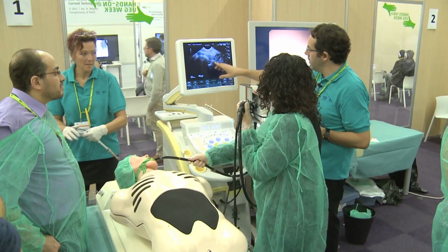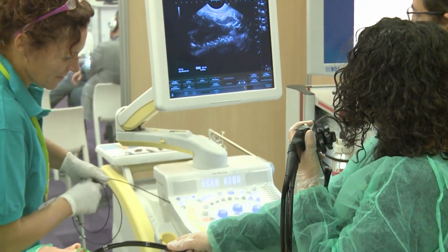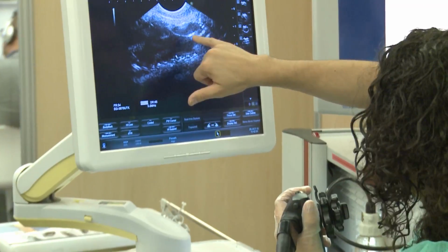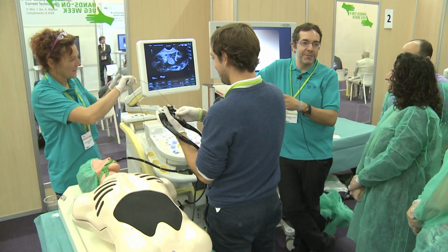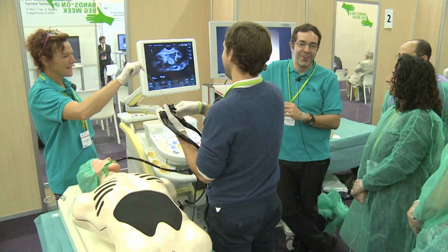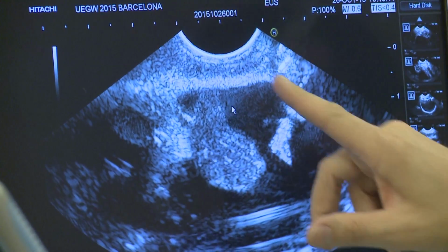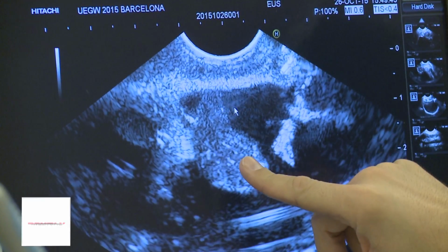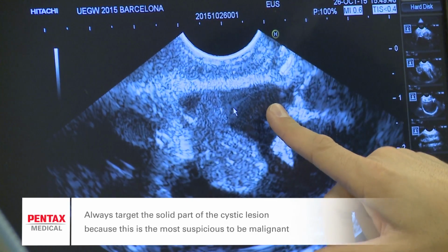Okay, let's go here. So this is what we want to target now. I will see if I'm going to let him do the procedures, the FNAs, next week in my patients or not. Just think that this is a cystic lesion with a solid part. So always your target is not the cystic part, but the solid part.